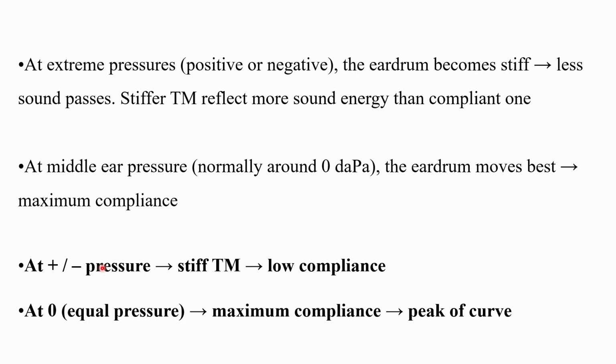So at positive or negative pressure, the tympanic membrane becomes stiff and there will be low compliance, while at equal pressure there will be maximum compliance with the peak of the curve.